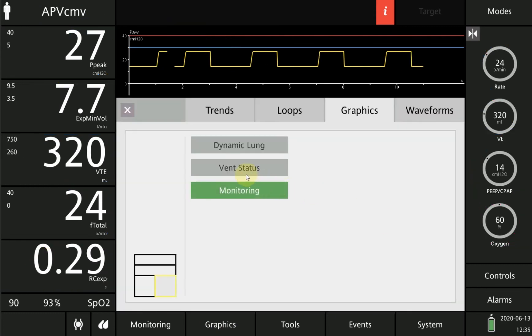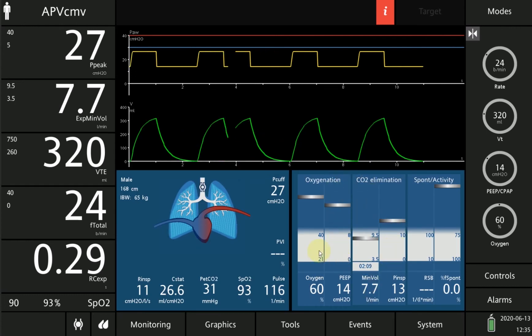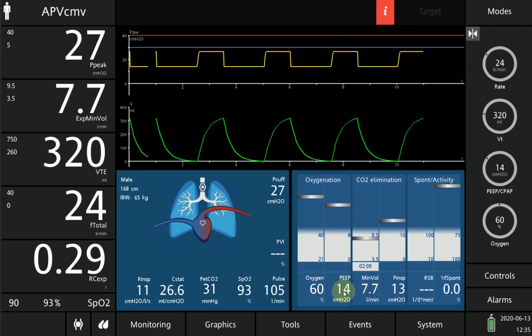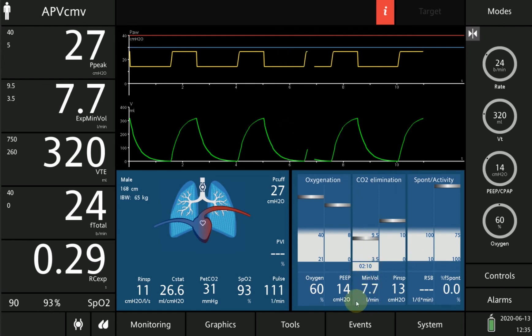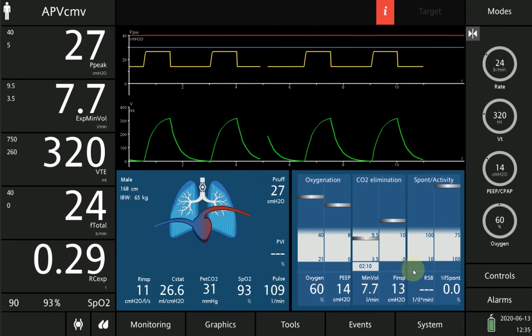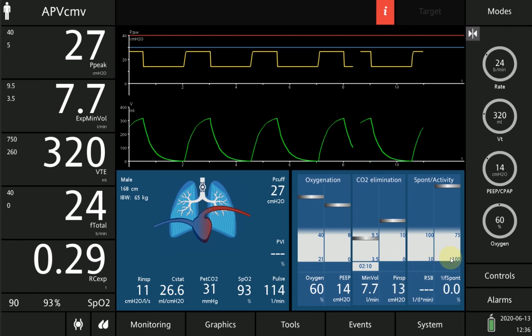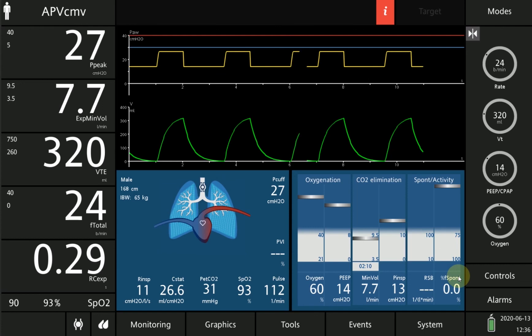On this ventilator you can also look at the vent status screen. The left panel shows oxygenation status: FiO2 60% and PEEP of 14. The middle panel shows ventilation at 7.7 liters per minute and the pressure used to deliver the targeted tidal volume. The right panel shows the patient's spontaneous activity — at this point the patient is sedated, probably paralyzed, and showing no spontaneous activities.